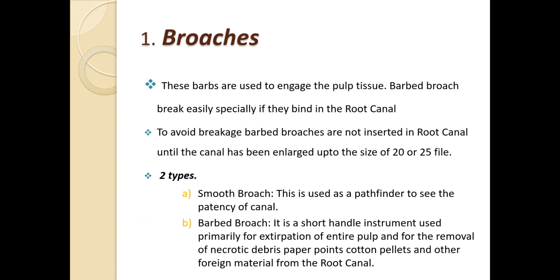Now we are coming to broaches. These barbed broaches are used to engage the pulp tissue. Barbed broaches break easily, especially if they bind in the root canal. To avoid breakage, barbed broaches are not inserted in the root canal until the canal has been enlarged up to the size of a 20 or 25 file.